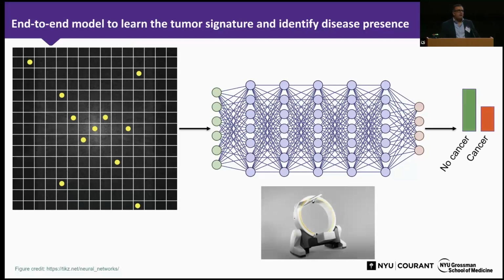Right? And another thing I want to argue is that if we can build such a system, another conjecture is that one of the byproducts would be that you may not even need very high quality measurements of the k-space in order to come up with the binary answer. It's not just about the quantity, it's also about the quality. You might do away with a very low quality, small amount of measurements and still get the answer, yes or no.